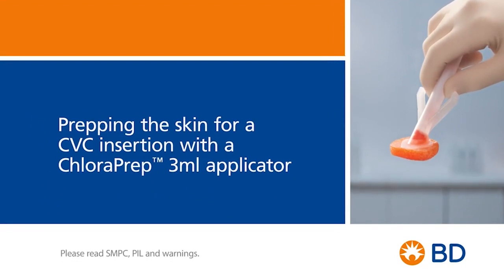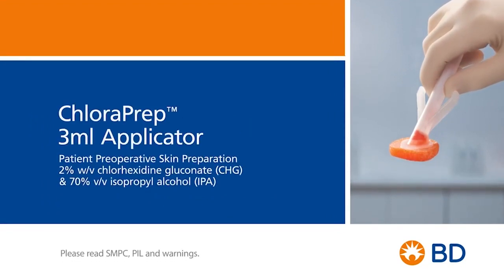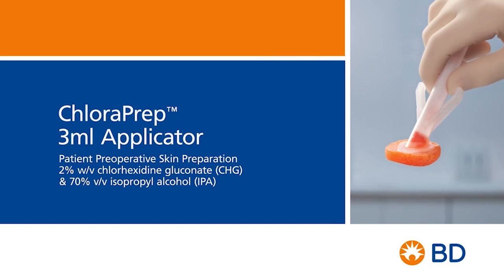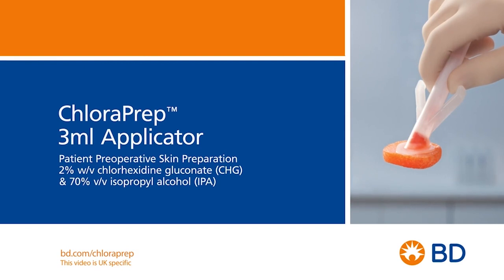In this video, you will learn how to prep the skin for a CVC insertion with a Chloroprep 3ml applicator. Before using the Chloroprep 3ml applicator, please read the summary of product characteristics, patient information leaflet and warnings. These are all available from our website. Check for chlorhexidine gluconate allergy, batch number and expiration date.